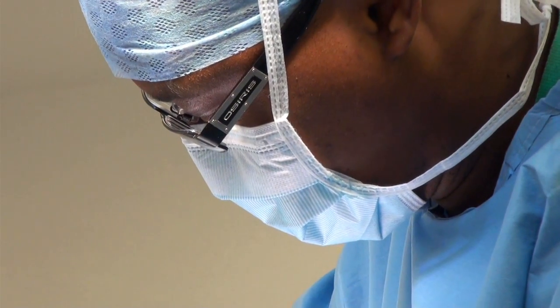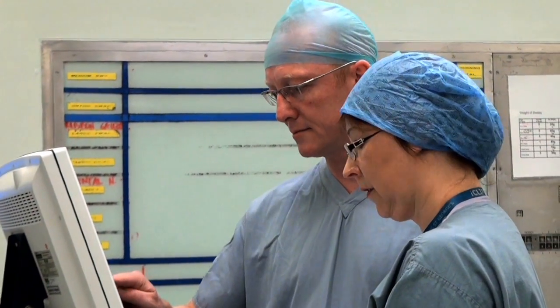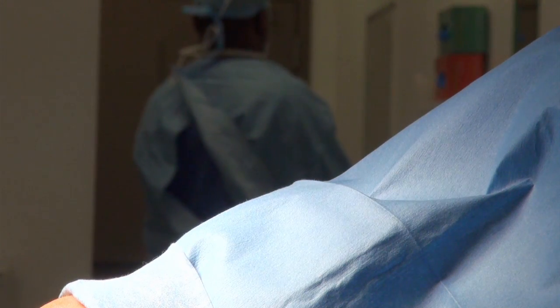Clinicians, surgeons and nurses continue to recognise the positive effect of electrochemotherapy in the treatment of appropriate cancer patients.